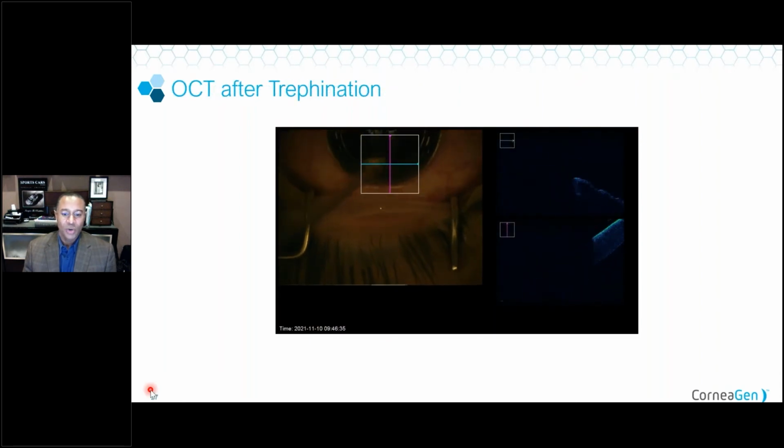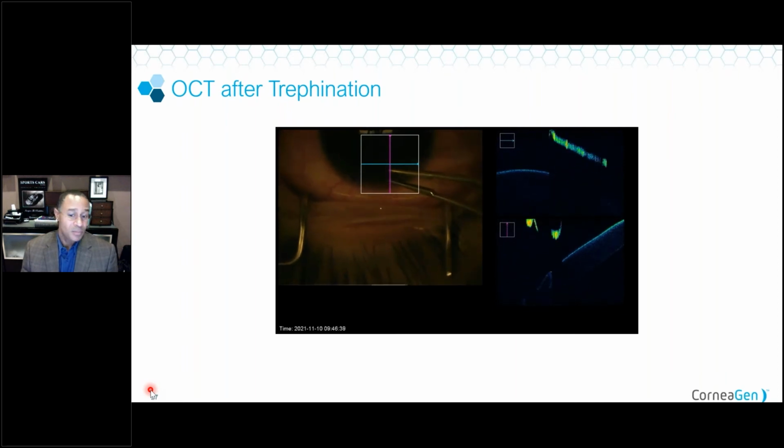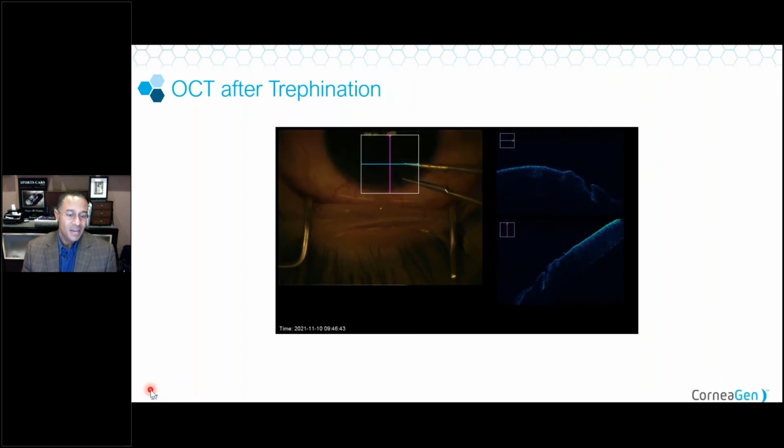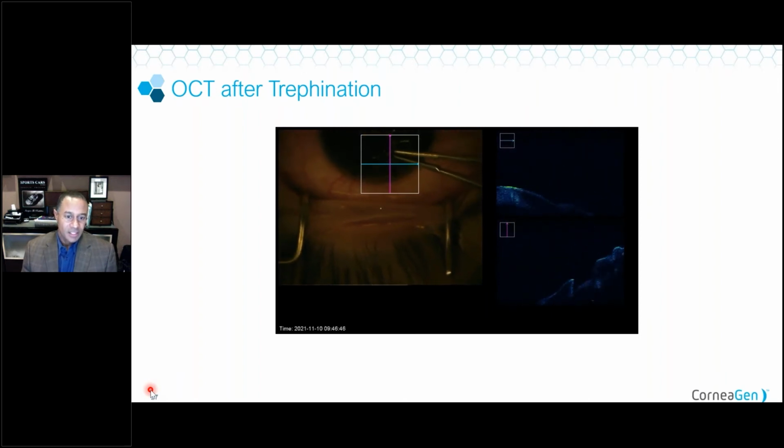I intentionally don't go all the way through with the trephine, even when I'm doing PKPs. Naturally, we don't want to do that in a lamellar, but even with PKPs, I always stop at this point. This allows you at this point to assess what you've got, whether or not you're going to be able to continue with surgery, if you need to make some change in plans. It gives you time to be calm and collect yourself before you move on to the next steps.